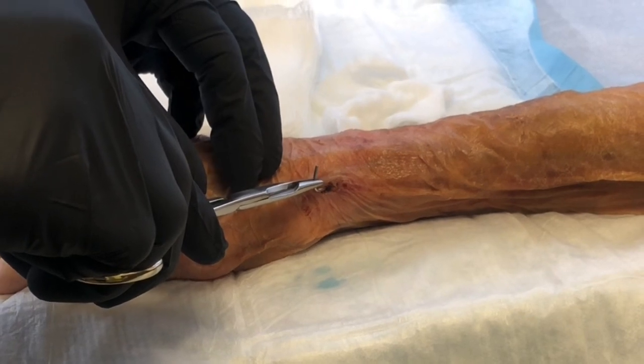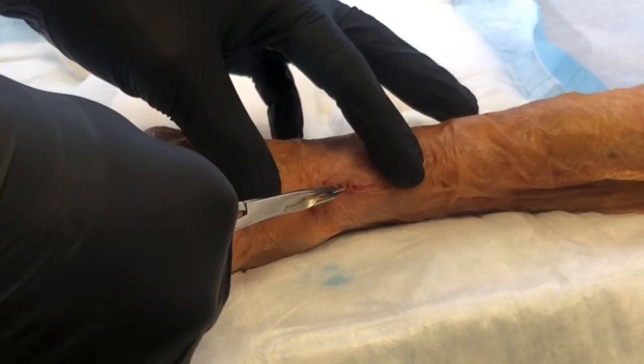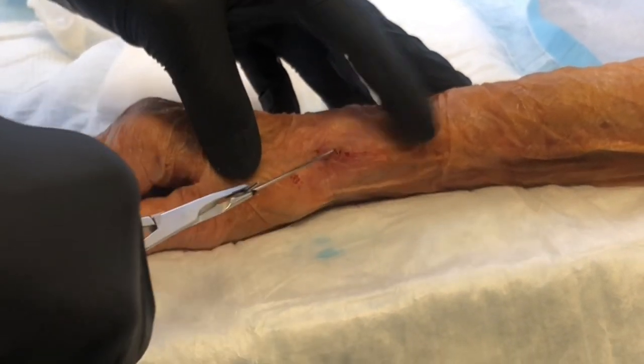This one is a little bit hard — I have to pull a little harder. Sorry about that. There we go. See, that's a good sign actually — that means that your bone is strong there. There we go.